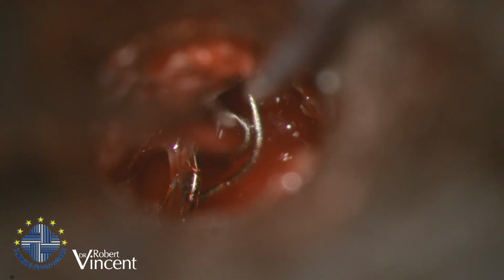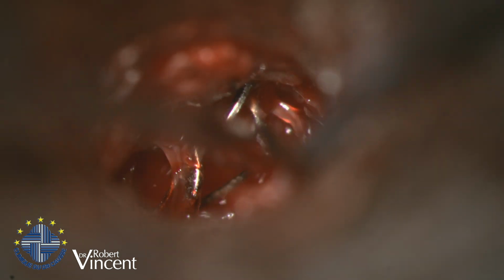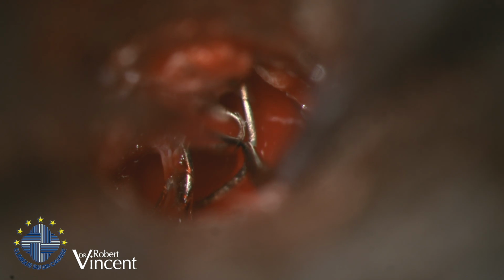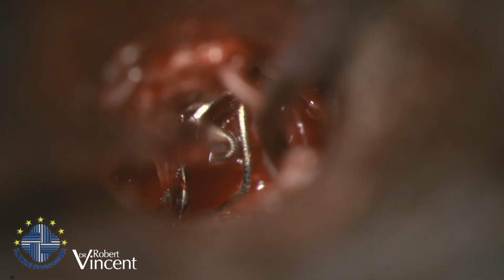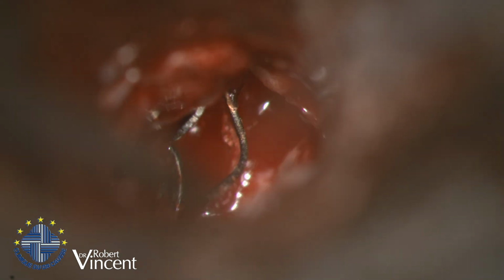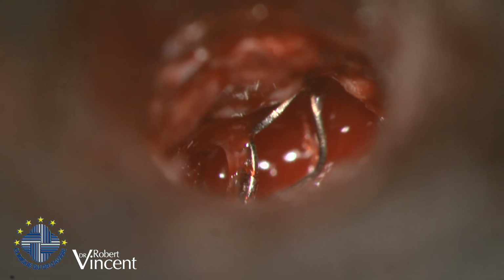The problem is the bleeding, but I think it's good to show the difficulties that we have when it's bleeding. We just have to wait and be patient with that. It's bleeding also because there is a lot of adherence. The chorda is really bad. I think I need to remove this one first. The first one? Yeah, the right one.